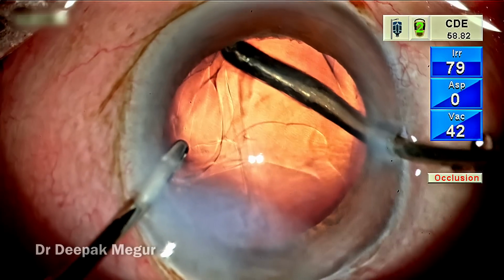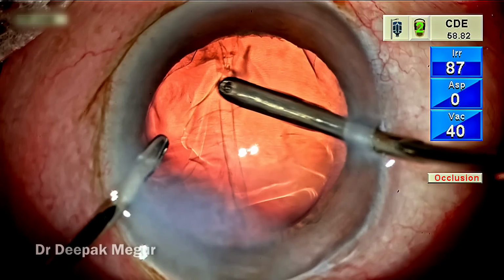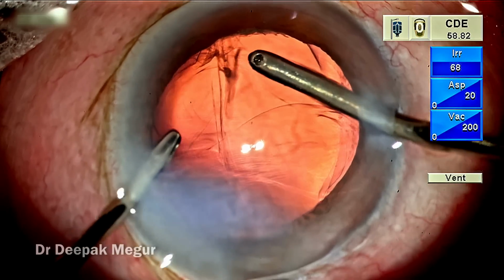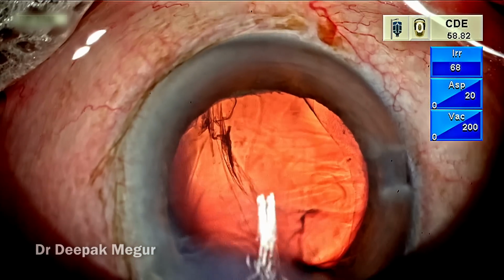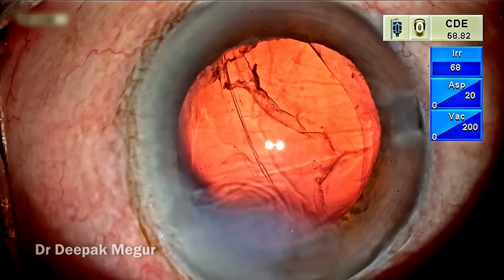To remove the cortex, I am going in with my bimanual. The moment I go in, the folds are increasing and now it looks like maybe there is a posterior capsular tear. So what do I do now? I can clearly see 2 vertical lines. Now I thought, okay, this definitely looks like a posterior capsular tear.